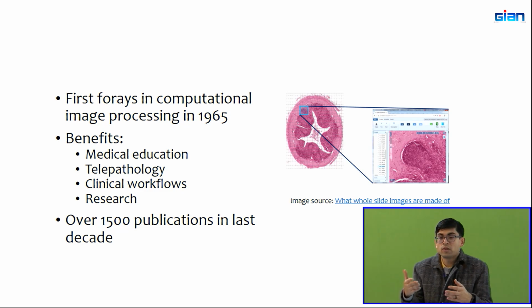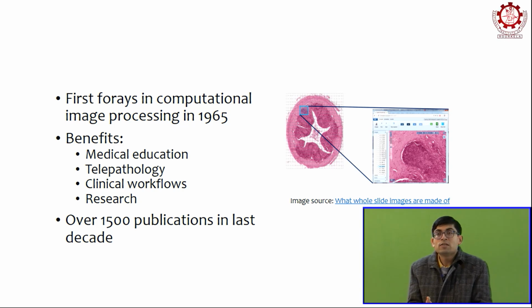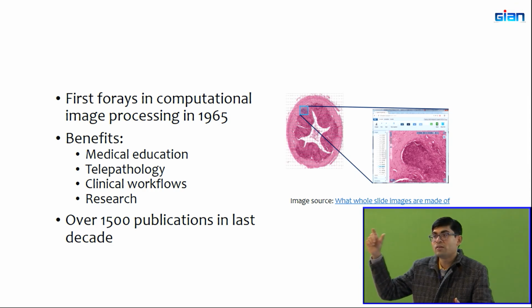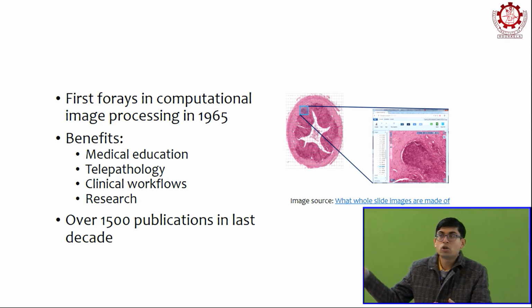Let's say there's a breast cancer slide that needs to be analyzed, and your hospital only has general pathologists who can provide their interpretation, but to get something more specialized, it has to be sent to a pathologist who specializes in breast cancer. To do that, you can scan and digitize the image and just send it over to them and get their opinion.